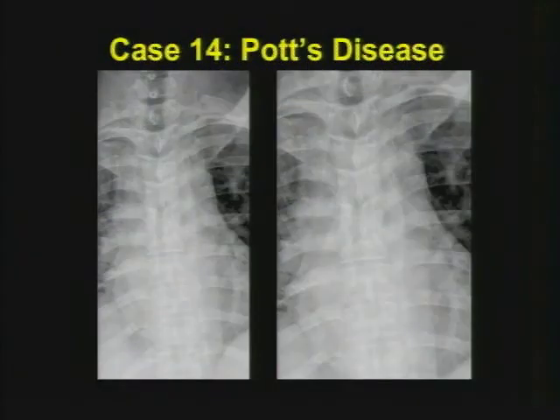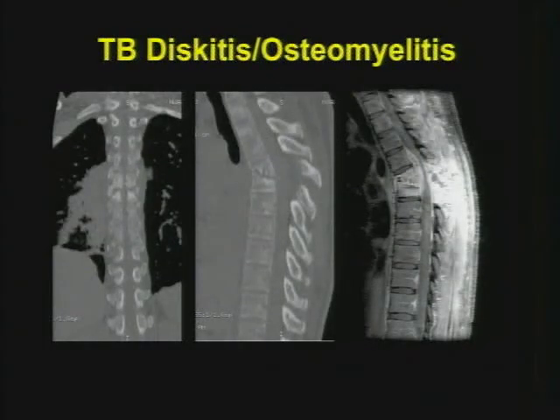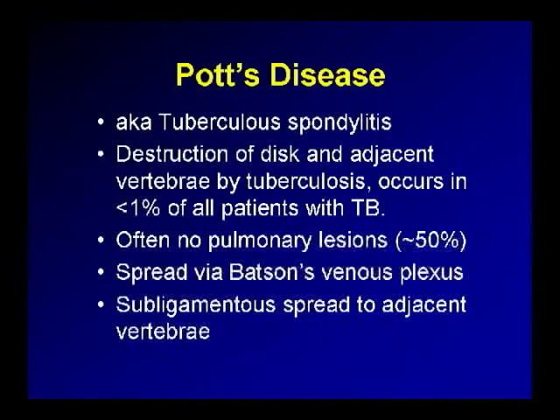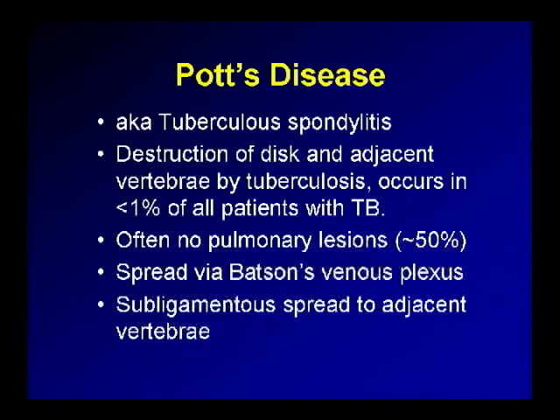Case number fourteen: chest pain, spine pain, back pain. In addition to aortic issues, always think about the spine. This was a case of Pott's disease — tuberculosis spondylitis. Notice the extensive bony destruction on CT and MRI, the focal kyphosis, and the subligamentous spread of the epidural abscess on sagittal MR. You often have very severe local destruction of the disc and adjacent vertebral bodies. Importantly, you can get tuberculosis spondylitis without pulmonary disease — that situation is very common. It spreads via Batson's venous plexus and subligamentous spread to adjacent vertebral bodies.